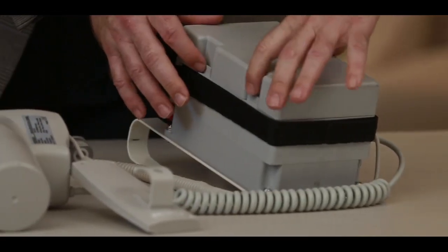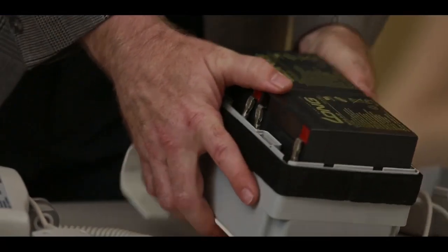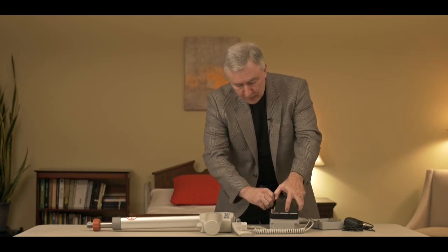There are two tabs located on the control box that you can squeeze and just lift the cover off, and inside you'll see the batteries. There are two individual battery cells that are wired together. These batteries are available from Best Care, your dealer, or sometimes locally. The batteries are probably the number one reason the system fails, but it's very easy to access them.